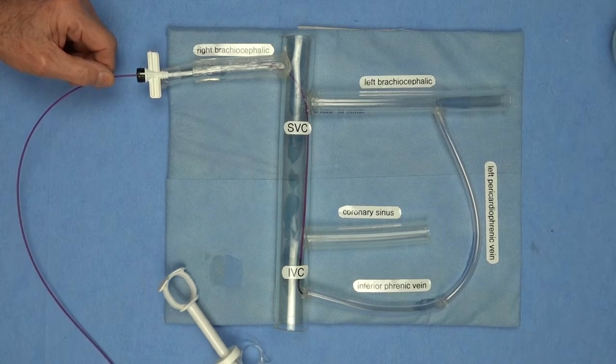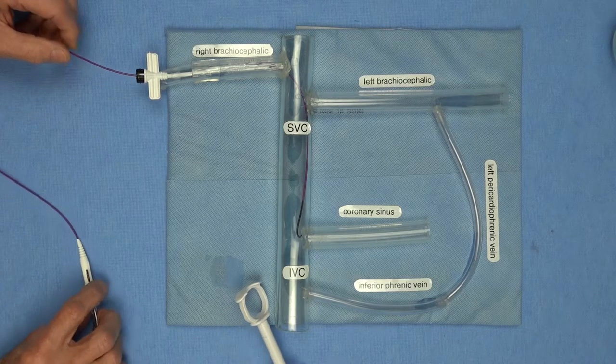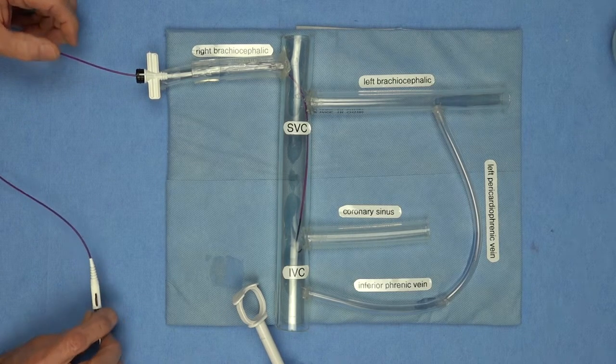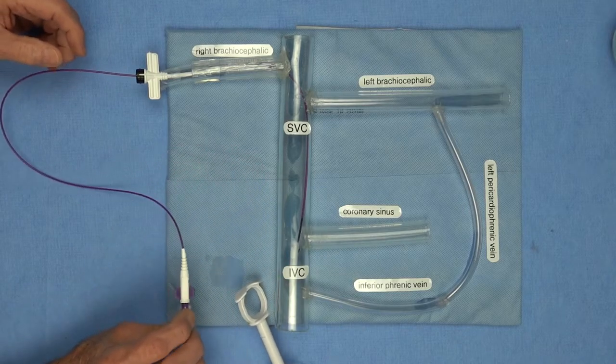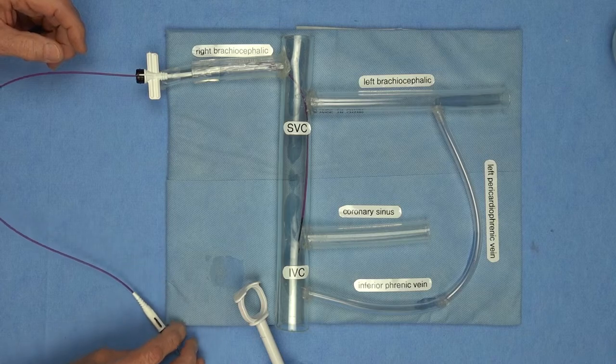And so what you can do is you can take a catheter, and in this case, I'm using a Merit standard curve that we use for the CS.